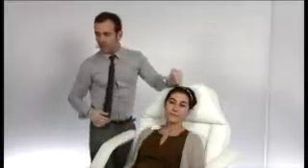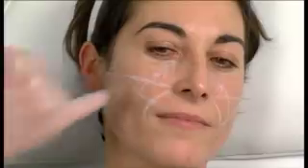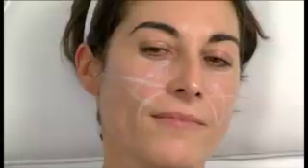Yanni, that's a really excellent comment, because I do exactly the same thing that you're doing. Nice. You've already made the point, but I'm going to make it again. You put a point over your no injection zone at the exit of the infraorbital nerve. There have been reports of prolonged anesthesia with both HA fillers and calcium hydroxylapatite when you're injecting on the epiperiosteal plane in and around that infraorbital nerve. So I think it is a very wise idea to do exactly as Yanni says there. Do not be injecting epiperiostally in that area.